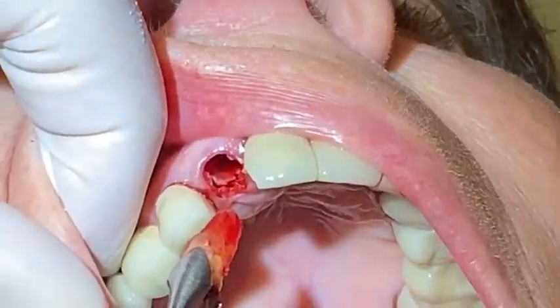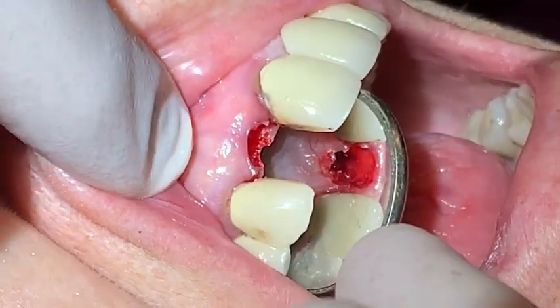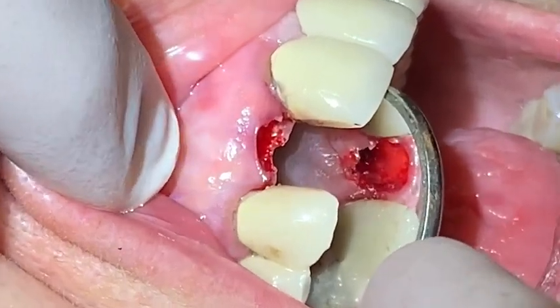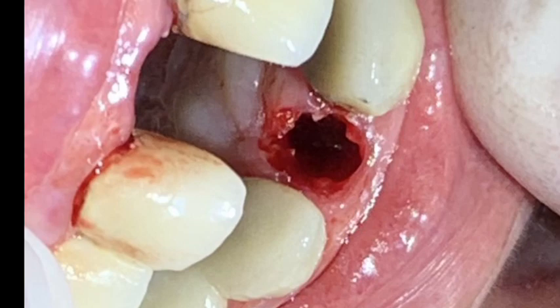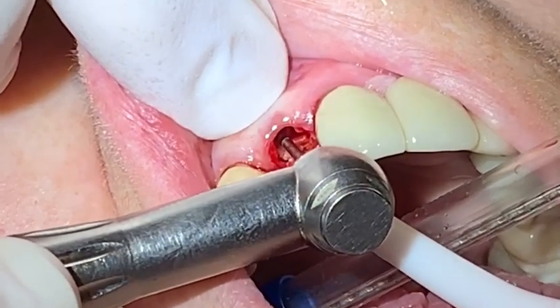The buccal plate was so thin you can see the light transmittal and blockage when the doctor's finger is moved over and away from the facial gingiva. This is typical of maxillary teeth in general. Once the tooth was removed, the process of placing the implant began.